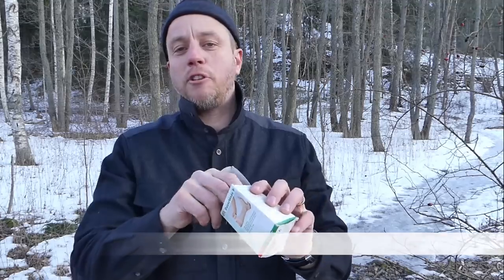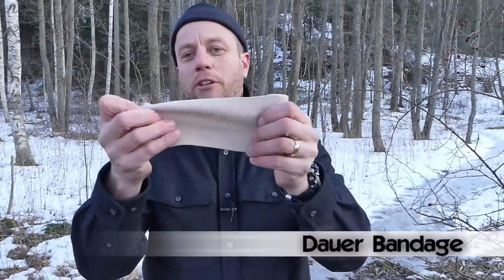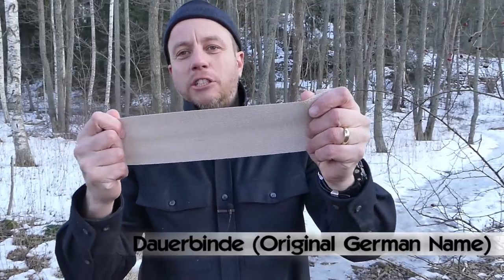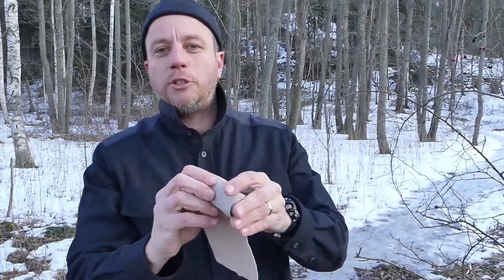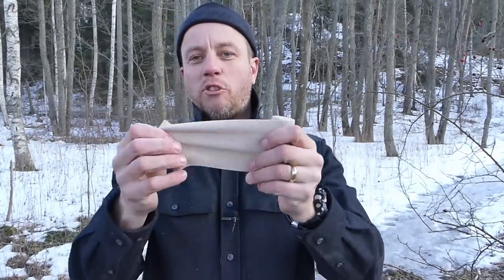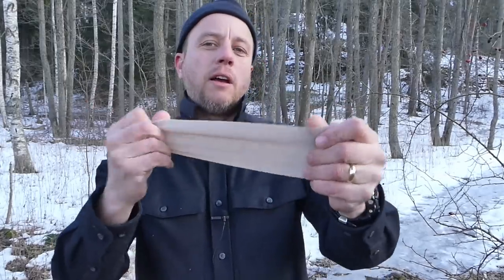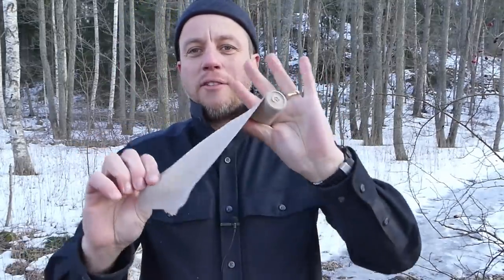Dauer Bandage is the proprietary name for a high-quality compression elasticated bandage. It's manufactured in Germany but sold worldwide under the name Dauer. I urge you to seek out the Dauer brand or an equal quality — don't waste your time with cheap knockoffs. Get the real stuff because it's only about five dollars, five pounds, five euros — in that area for seven meters.